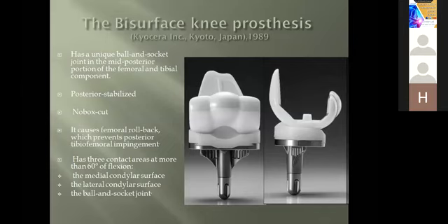This is from the biomechanical point of view. The problem is that on a practical basis, this design failed to show acceptable, good change in patient satisfaction and proprioceptive rehabilitation for the patient after surgery. That's why it's not widely distributed.